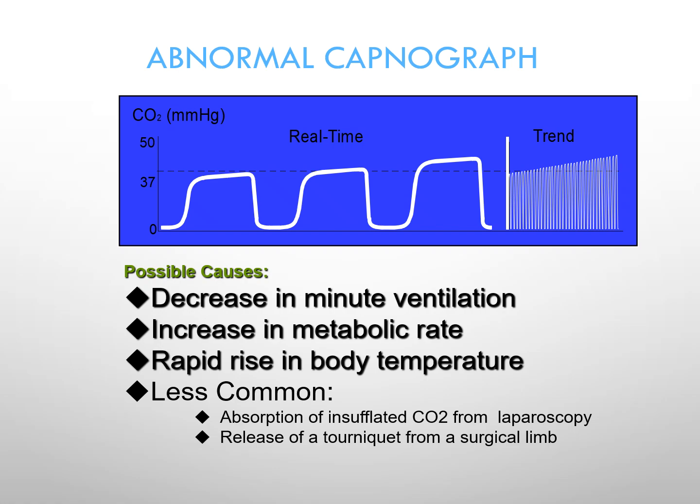There are also some less common causes of this sort of phenomenon where the patient has had a laparoscopic surgery. They've had a lot of carbon dioxide gas pumped into their abdomen, if it's an abdominal surgery, so that the surgeon or surgery team could see what was going on down there and actually do the procedure. That CO2 is evacuated, but not all of it can be evacuated. So the body will absorb that. It has to go somewhere. It ends up in the bloodstream, working its way to the alveolar capillary membrane to be exhaled.